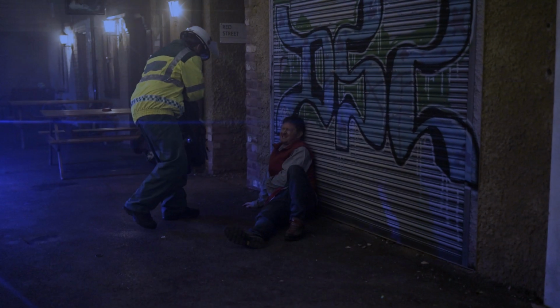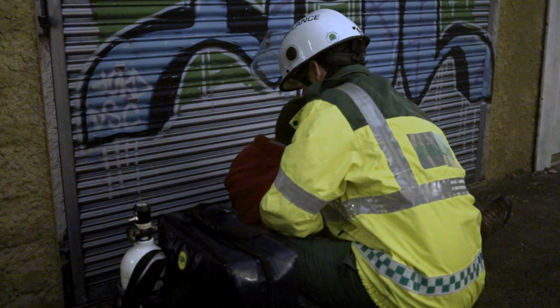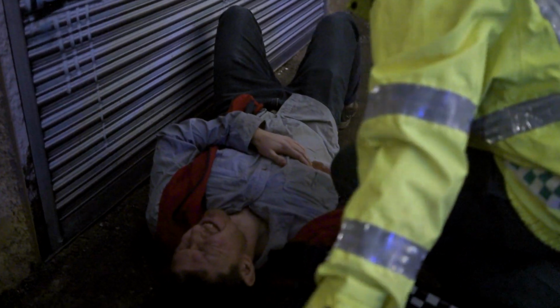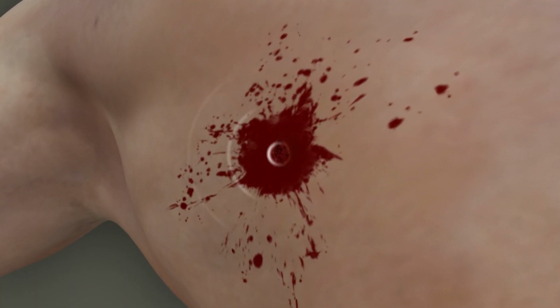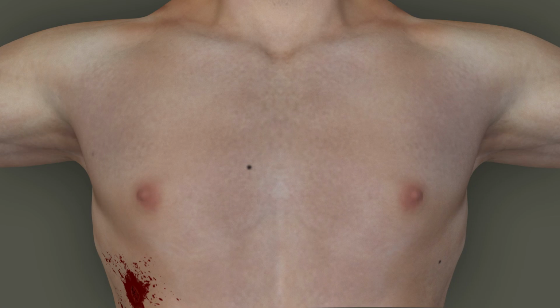The following training video is a guide to using Foxseal Vented according to the product's indications and packaging instructions. When responding to a casualty, it's important to identify the signs of a life-threatening chest injury. These could involve sucking or hissing sounds coming from the chest wound, frothy blood coming from the chest wound, casualty coughing up blood, shortness of breath or difficulty in breathing, unequal chest movement.